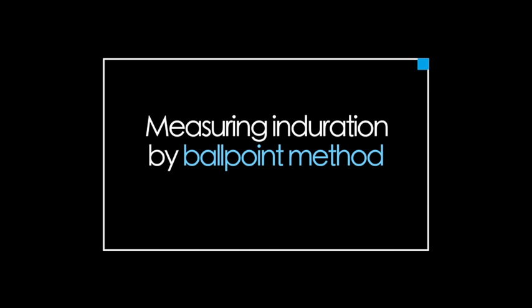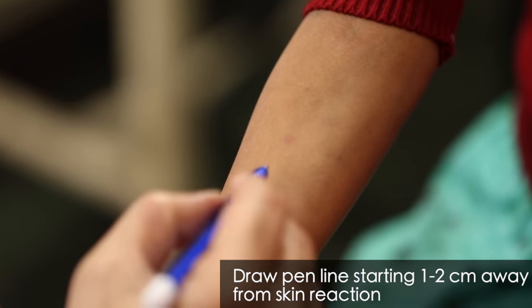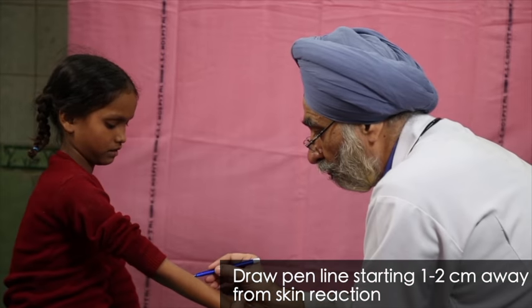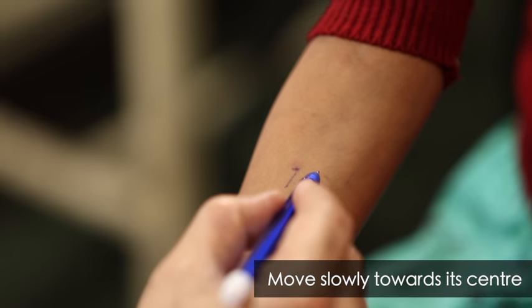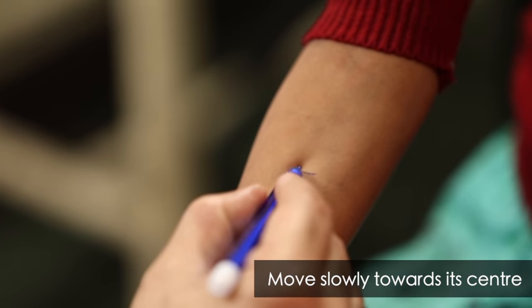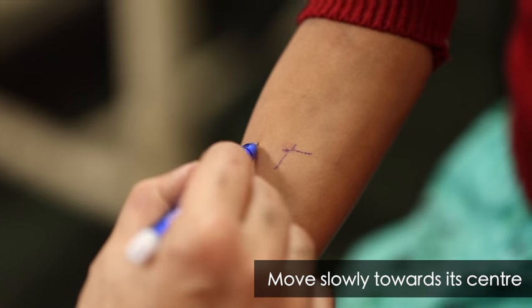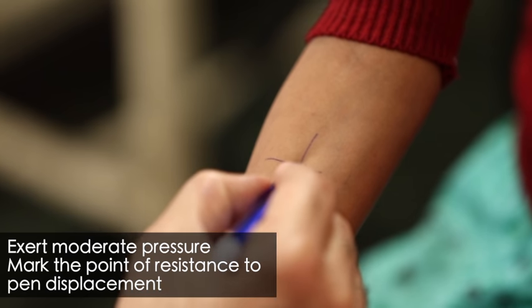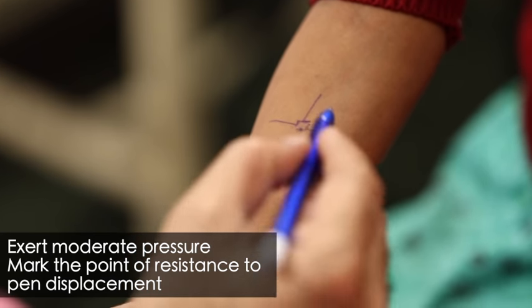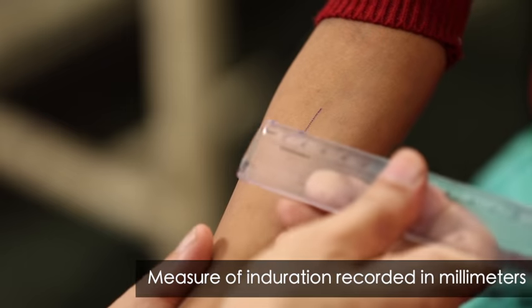Induration can also be measured by the ballpoint method. In this method, a ballpoint pen is brought from the edge of the arm towards the injection site, exerting moderate pressure against the skin until a resistance is felt due to the raised margin. The point where resistance to pen displacement occurs determines the outer limit of the induration. The width of the reaction is thus identified across the horizontal axis of the forearm.